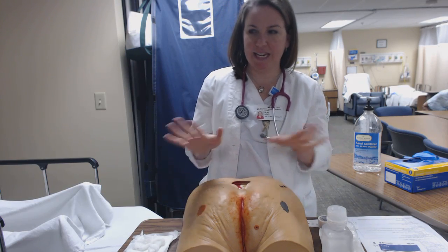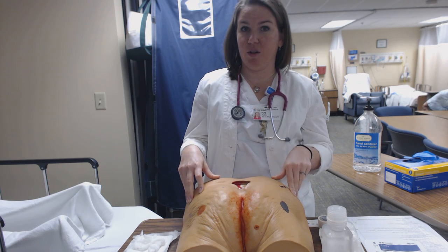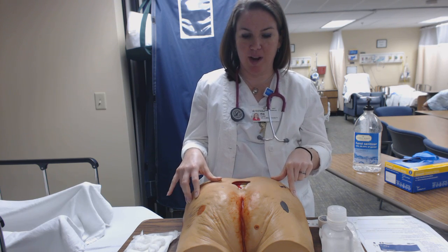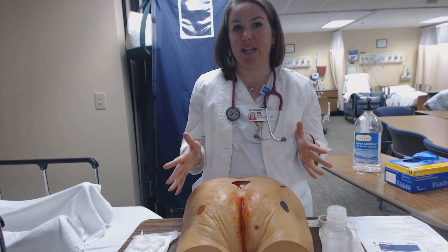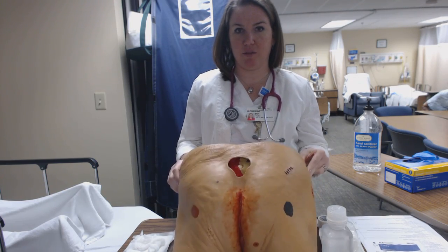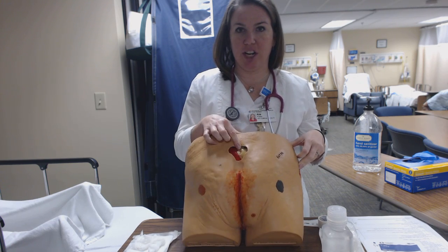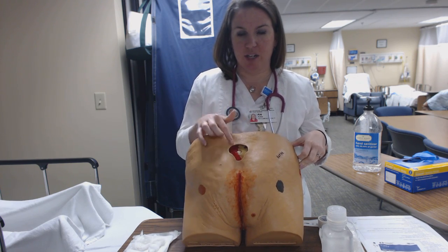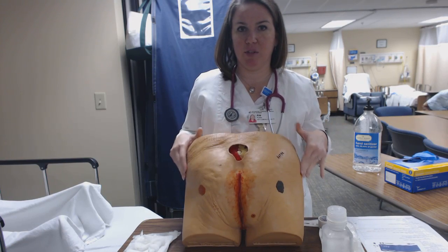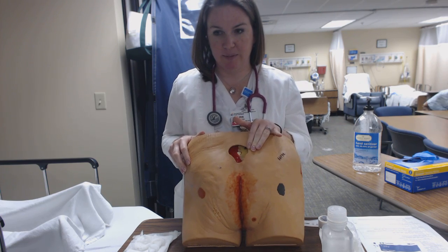Hello everybody. Today we are going to talk about wound care, not sterile wound dressing changes, but when you have a dirty type wound. So if we're looking at Mr. Butts here, you can see that there are several types of wounds that he has. We're going to actually change his stage 4 dressing. But before that, we're going to talk about the different stages of wounds from pressure that we can see.